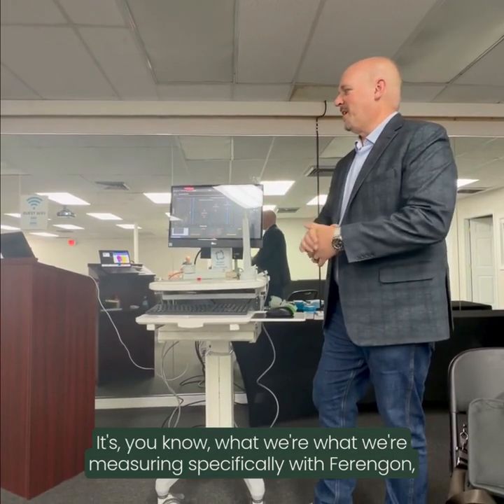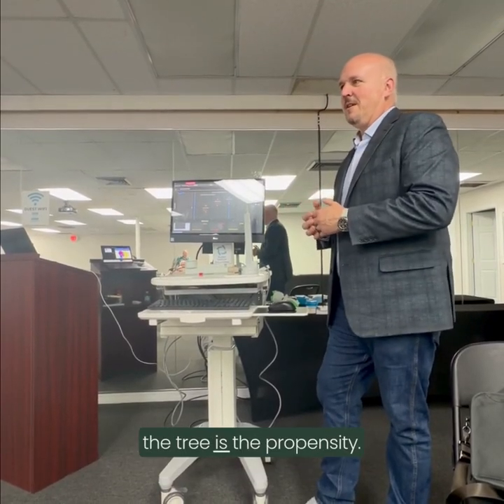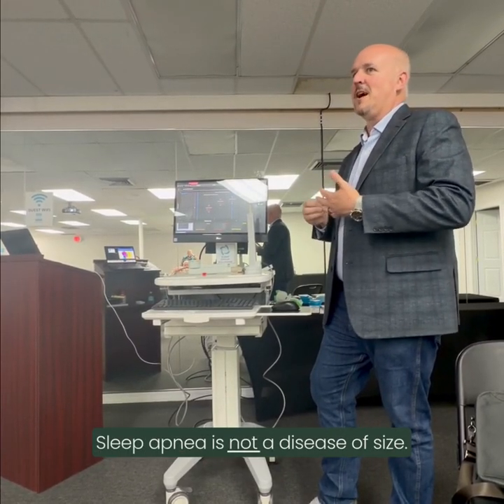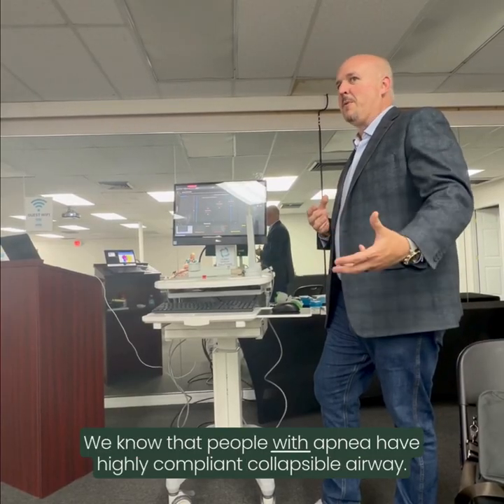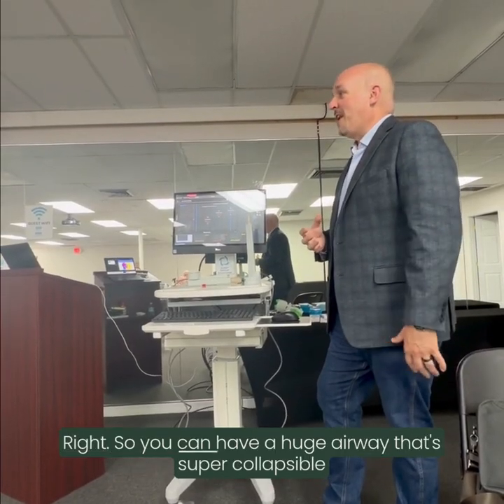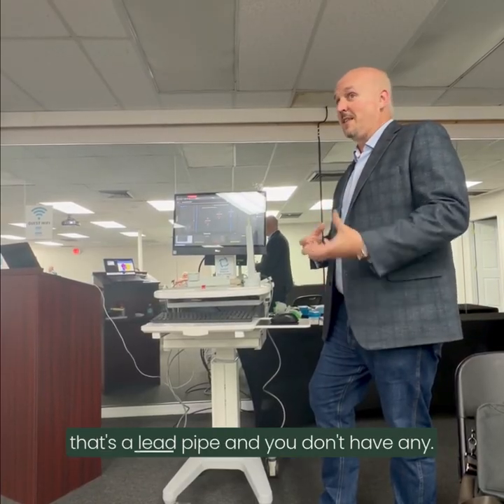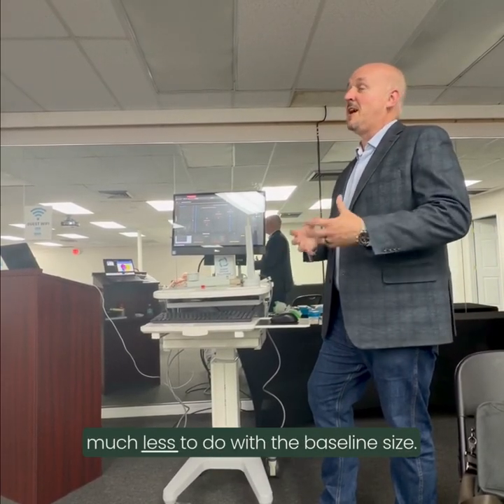Dan, you addressed it perfectly. What we're measuring specifically with pharyngometry is the propensity and ability for the airway to collapse, right? Sleep apnea is not a disease of size, it's a disease of compliance and collapsibility. We know that people with apnea have highly compliant, collapsible airways. People that don't have apnea don't. So you can have a huge airway that's super collapsible and have severe sleep apnea. You can have a tiny airway that's a lead pipe and you don't have any apnea. So it has much more to do with the flexibility, much less to do with the baseline size.